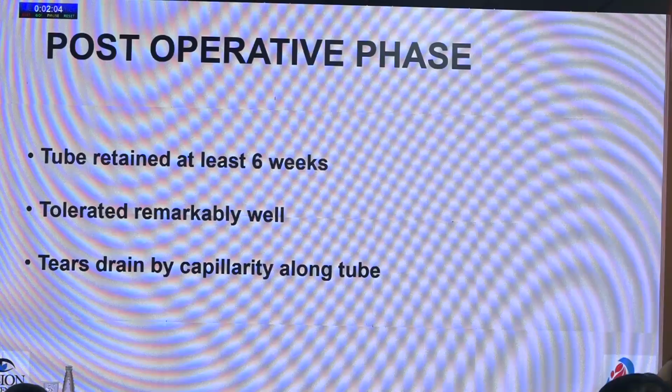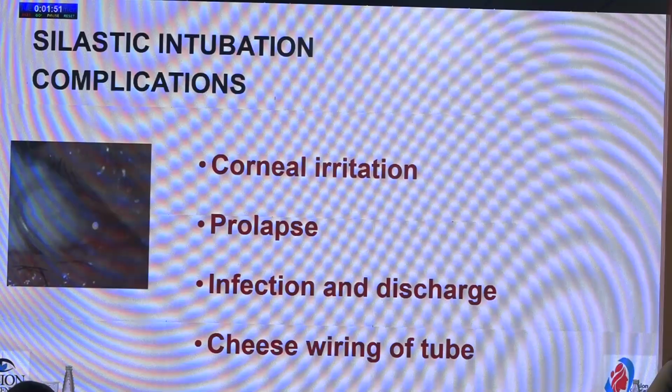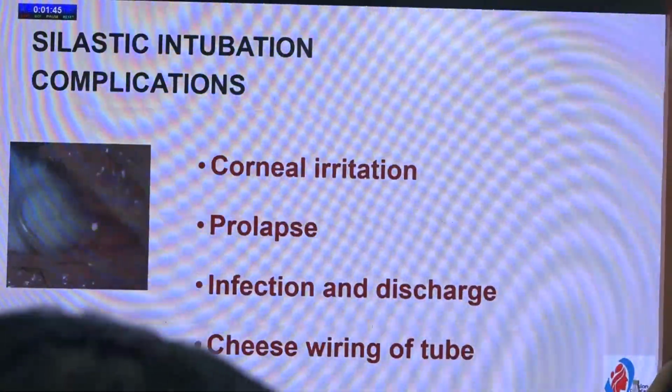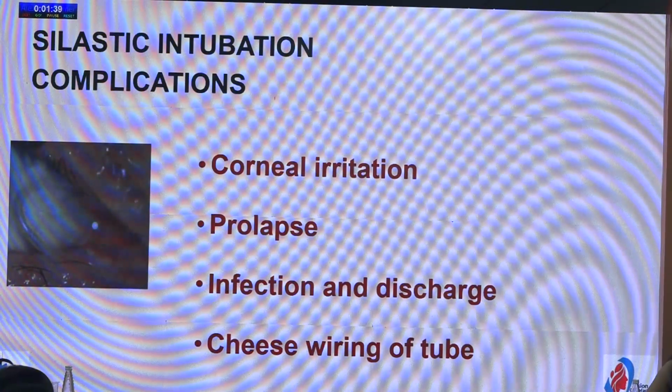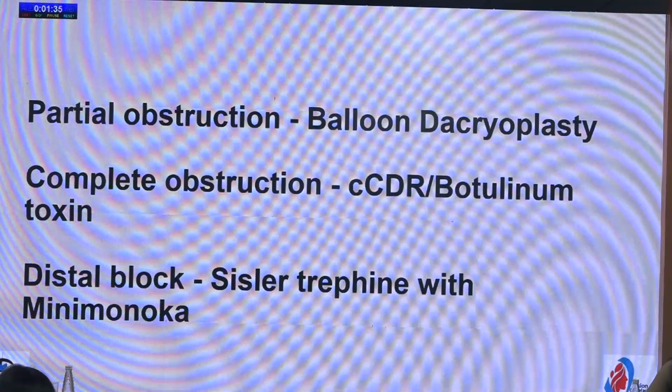Post-operatively, this again is debatable, whether you want to keep the tube for 2 weeks, 4 weeks, 6 weeks. The longer you keep it, again, the chances of getting infected is higher. And also you can have complications like the tube extruding and causing irritation, and even cheese wiring of the tube if the patient forgets that they even have a tube and need to get it removed. So it elongates the punctum too much. That's also not good.